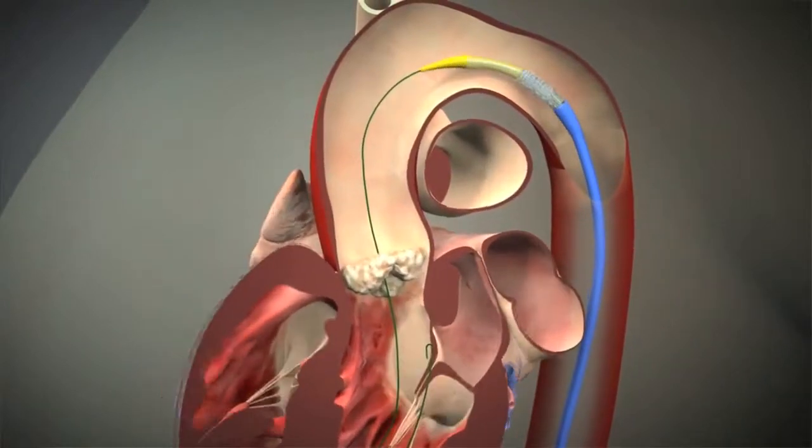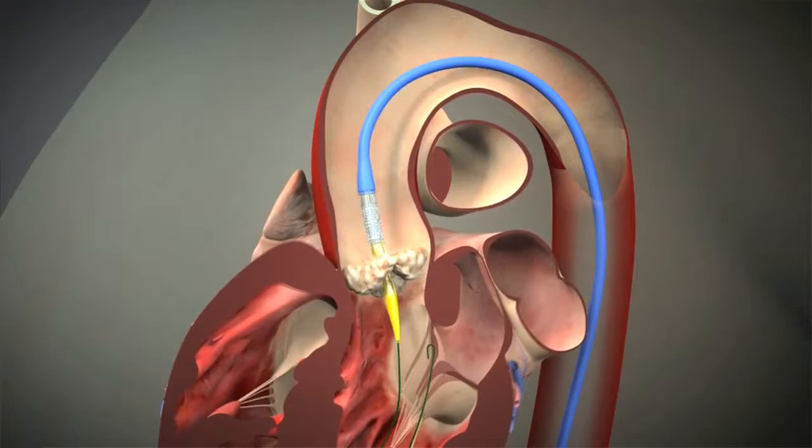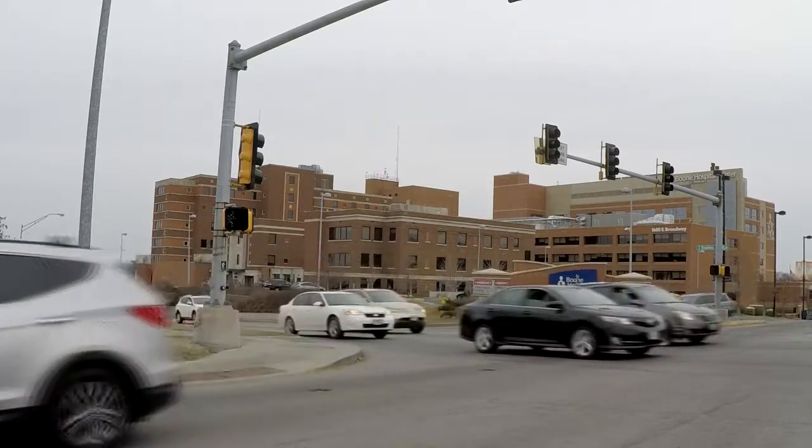Once the TAVR stent is placed into the aorta, the crushing of the old calcium can push on the pacemaker structure of the heart, causing your heart to slow down. As a result, you would need a pacemaker placed prior to being discharged. We monitor this throughout your hospitalization, and we put temporary wires in at the time of the procedure in case you do need a pacemaker at that time. In general, discharge from the hospital is not delayed by having a pacemaker after TAVR.